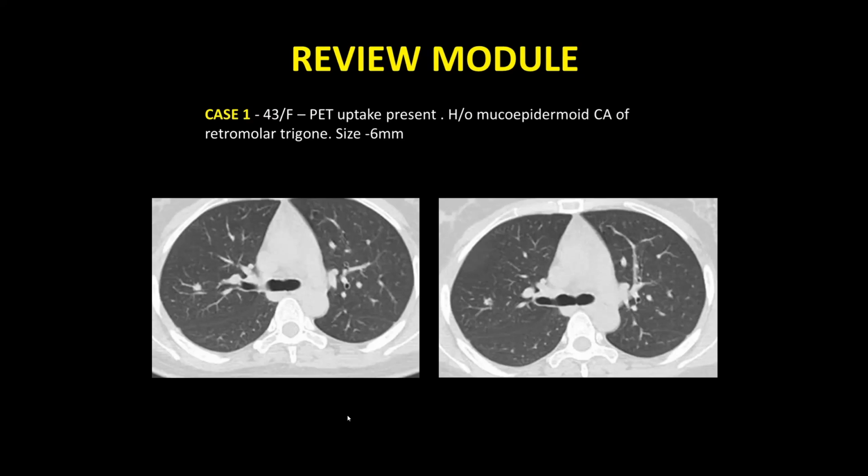Okay, so that was the exercise to revise and see. In this kind of lesions, if it's more than 8 millimeter, then PET might help. But actually, in this, even though it is 6, it did show uptake, not growing. So the only way to see how this is progressing is following it up further and seeing whether it remains stable.